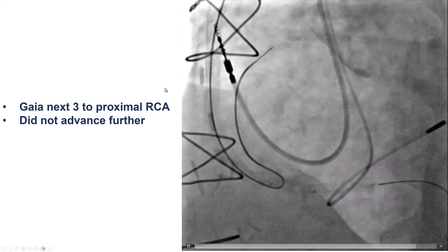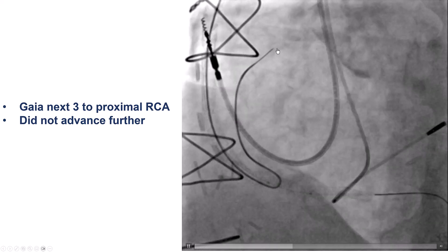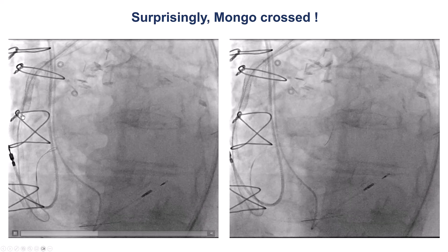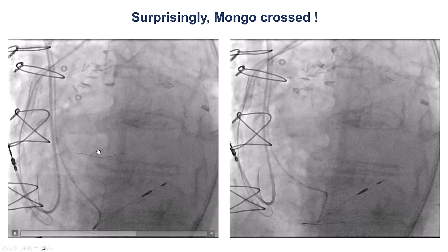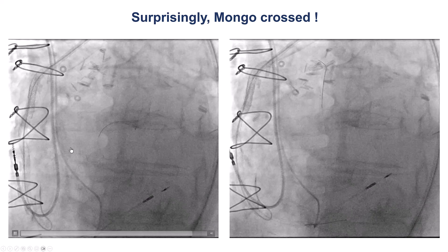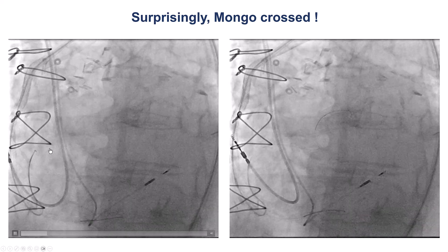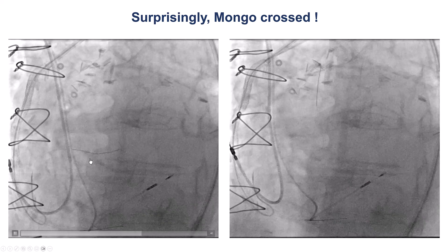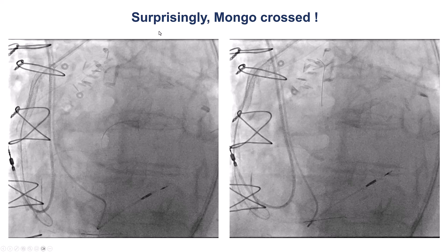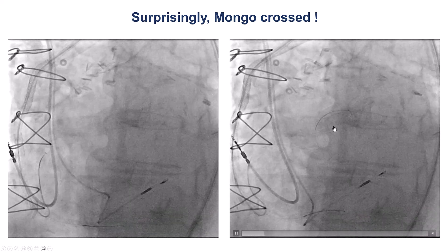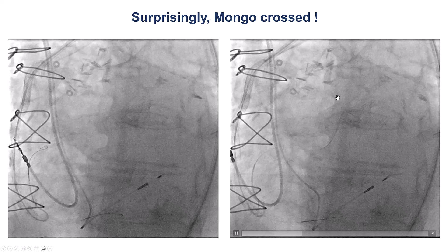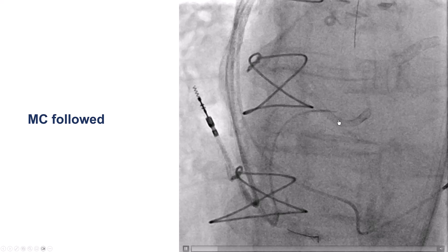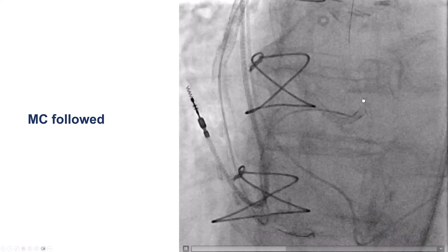We tried various wires including the Gaia 3, but could not go further. So we switched to the Gladius Mongo, with the idea to knuckle it and go to the ostium and then try to find ways to puncture. To our great surprise, the wire actually sailed — going into branches, then knuckling, then traveling along the course of the RCA and entering into the aorta. The wire is now out in the aorta, moving freely with the blood flow. Not very common, but a very nice surprise.